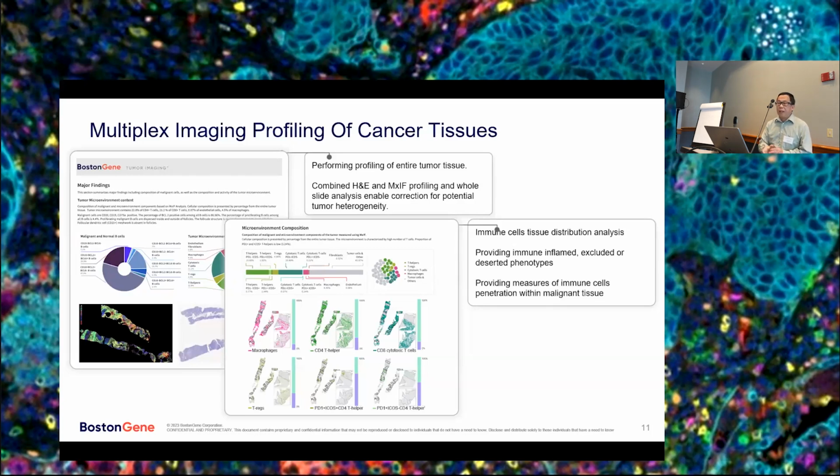We have a main finding summary, followed by details like immune cell composition, even HE incorporation, the annotations from the pathologist, and then the overview of immunolabeling, with a detailed breakup of each marker. All of this is then fed to the physicians, so they know exactly what they're dealing with.